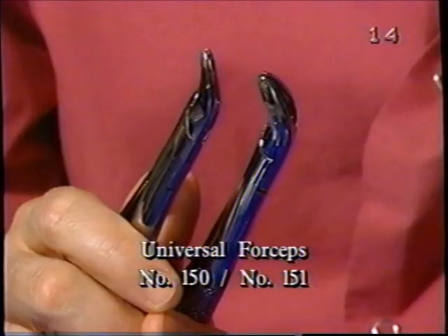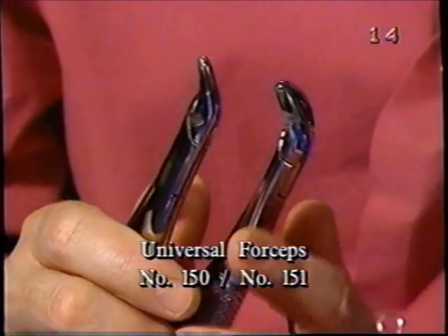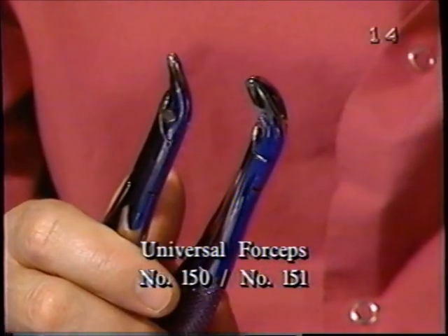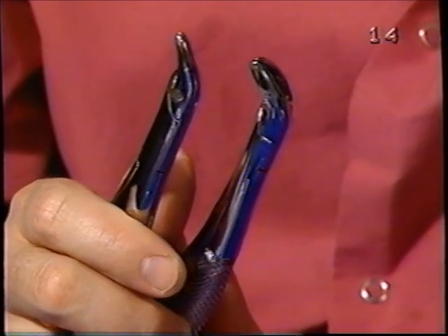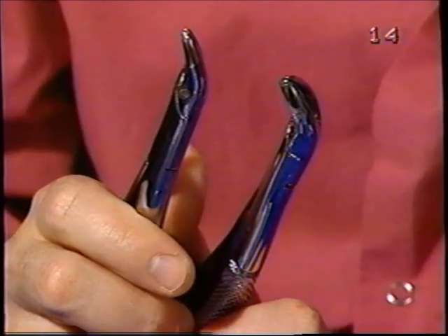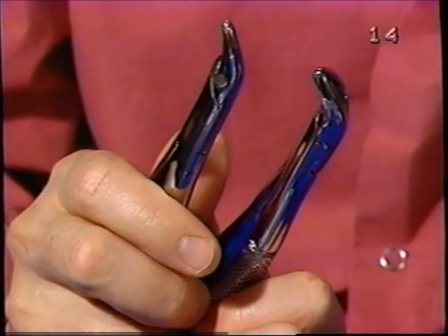As you can see, we have on this side the 151, and over here on my right, the 150, they're called universal forceps. And they can be used, the one on my left, the 151, to remove all teeth in the lower arch, and the one on the right, the 150, to remove all teeth in the maxillary arch.